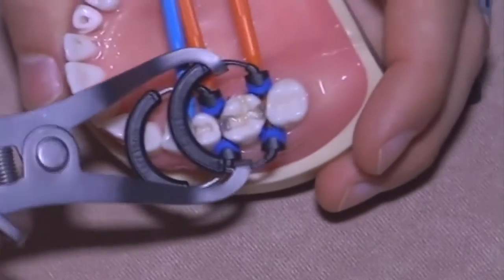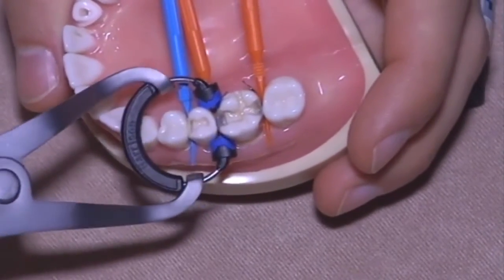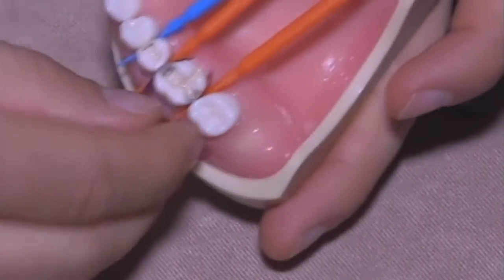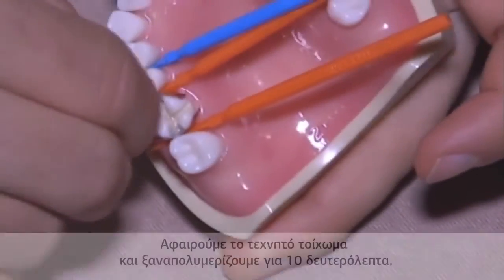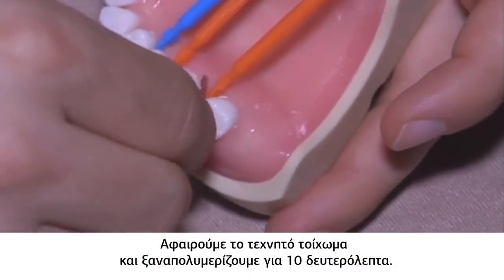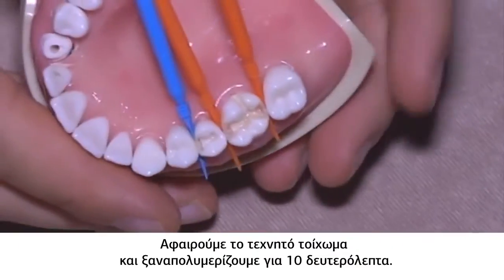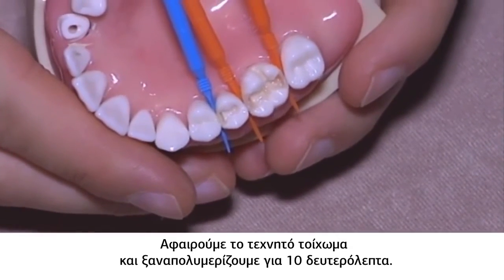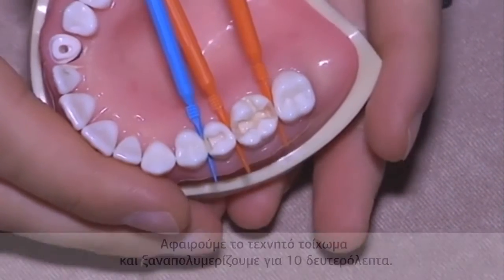Okay, and we're gonna remove everything. Here we are, and we have the 3 walls. Now we have 2 first class cavities, and it's easier to proceed with the restoration.